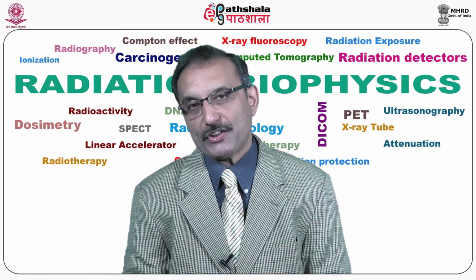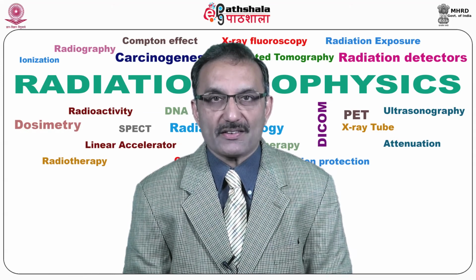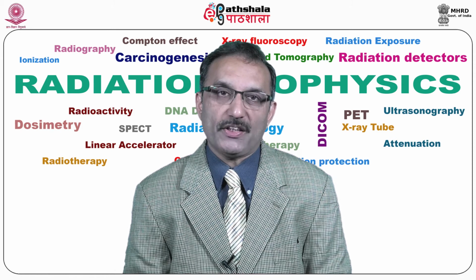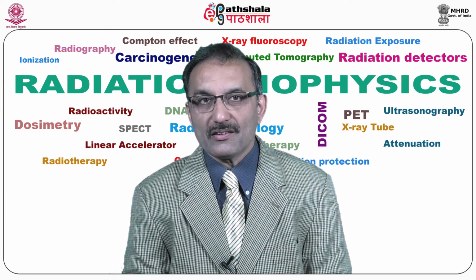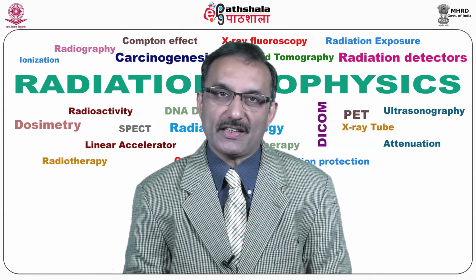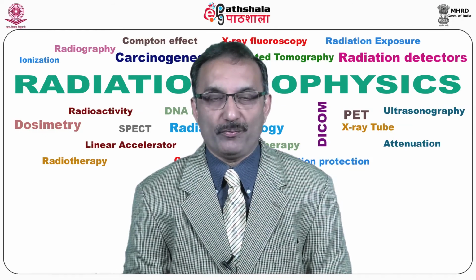As we talk about a special device, what is a device? This device is nothing but a combination of detectors where the radiation which is coming out from the patient is detected. The device used may be a gamma camera, or nowadays for molecular imaging we use positron emission tomography, and earlier when we started we were using a scanner or probe.